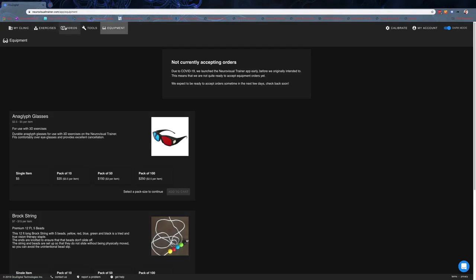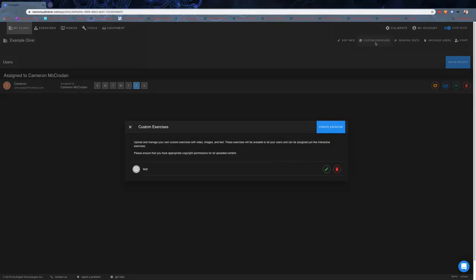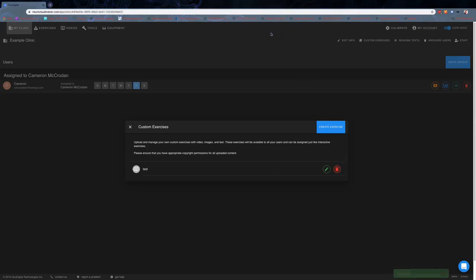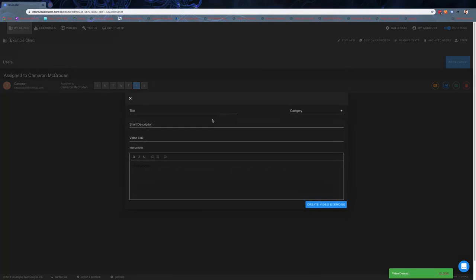Now that we've seen the exercises and videos, one of my favorite things about getting to use this program is the ability to upload custom exercises. Back in the main screen, the custom exercises area at the top right, you can see I had uploaded that test exercise. We can delete that one if we don't want it, but we can create an exercise.